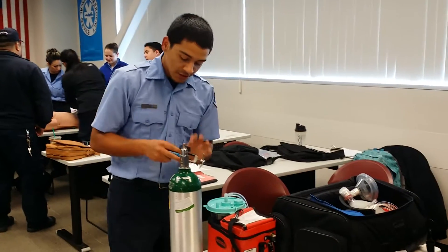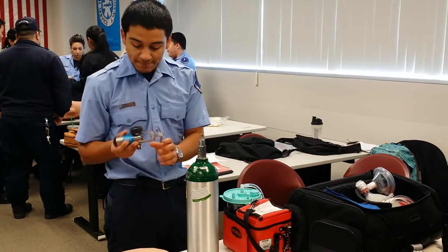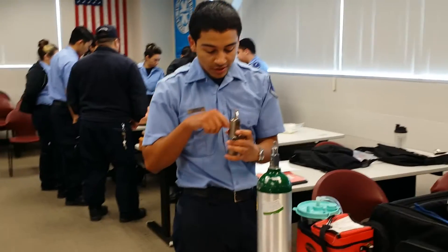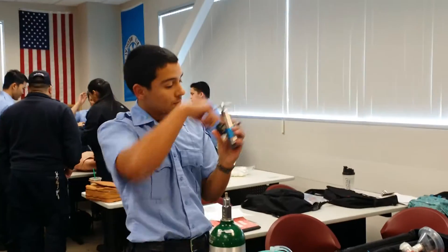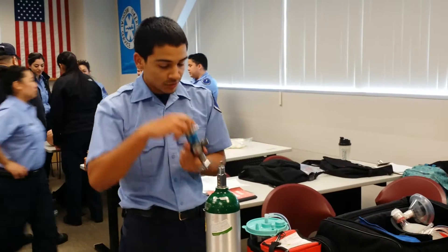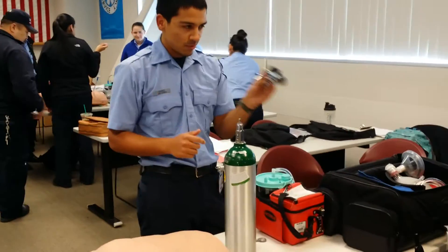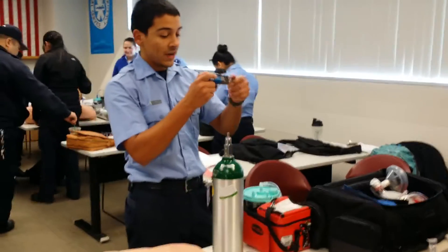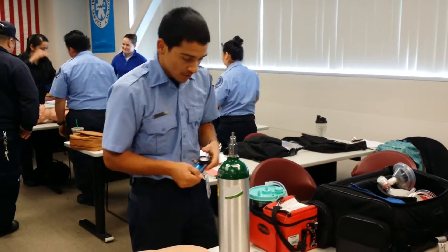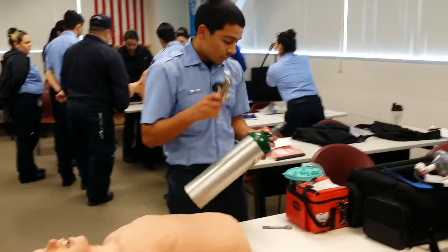This is my regulator. This is my gauge — I'm checking my gauge for any cracks, anything like that. These are my two prongs. My O-ring is right here — it's intact. This is my dial to control my liters per minute. This is my fastener. And this is my Christmas tree where I connect my hose. Two holes right here — that's where the prongs go.